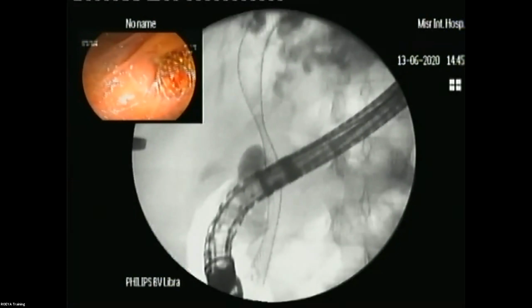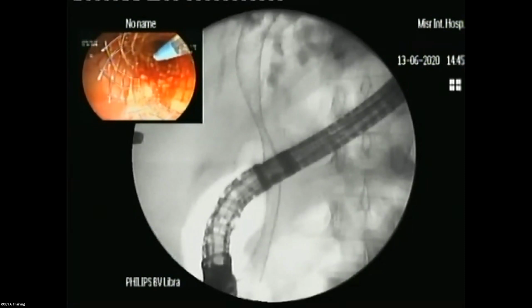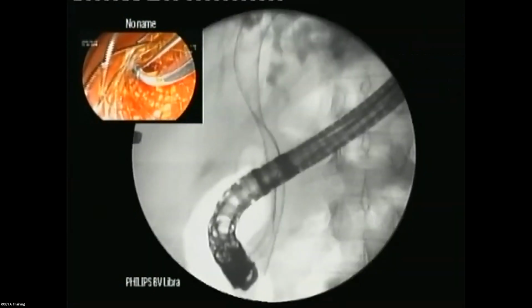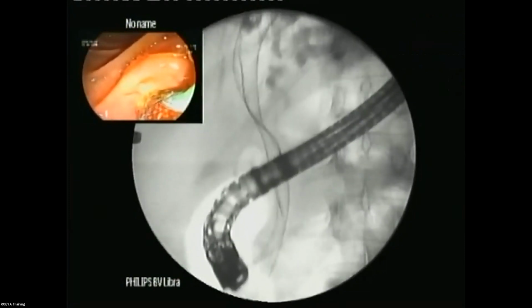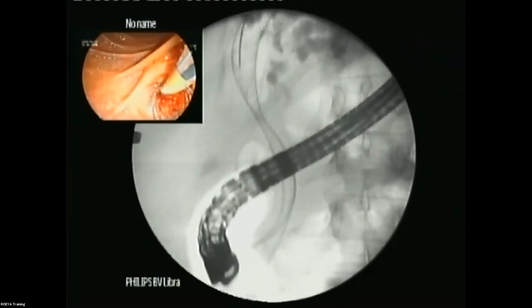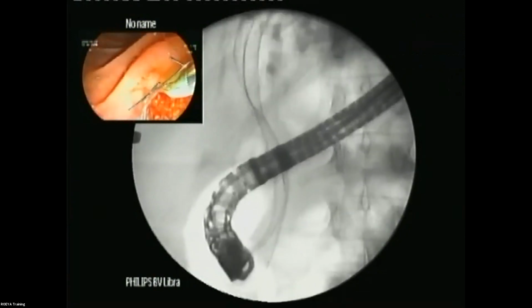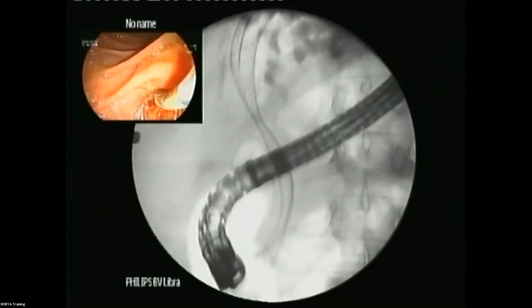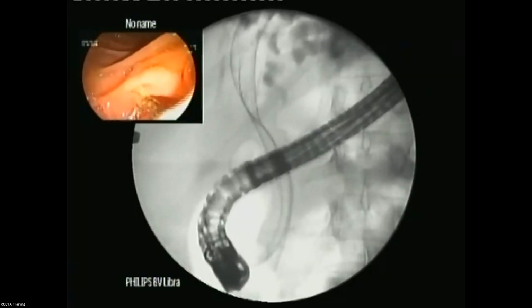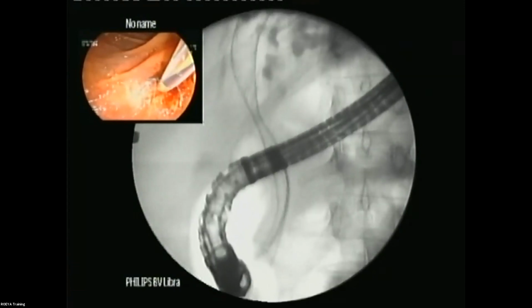Usually, if I do a stent inside stent technique, we use different stents which have a larger caliber of the opening. Is it better to use the sphincterotomes or what? So you see this stent, it's very good. It has small openings of the mesh, which gives it a good radial force, but it makes it difficult for me to do this stent in stent technique. Difficult to pass the wire inside this mesh. There is another stent with wide mesh, but I don't think it's one of them. But you have to try. You may succeed.